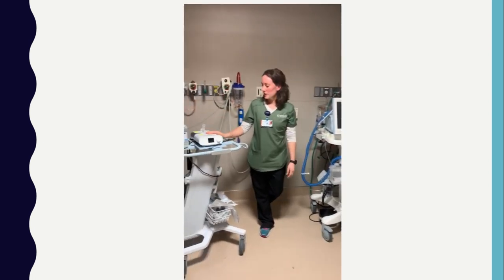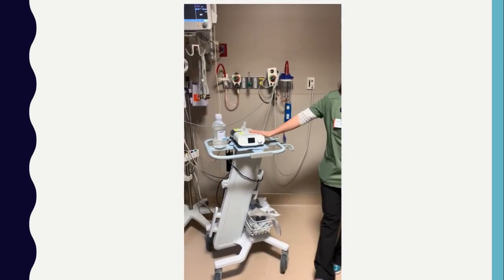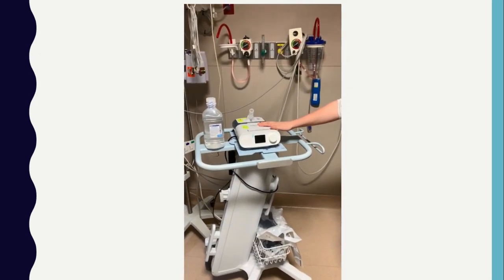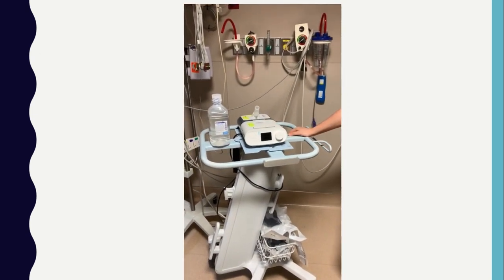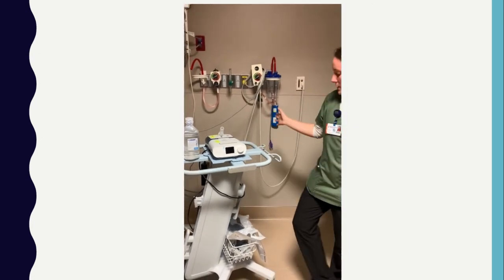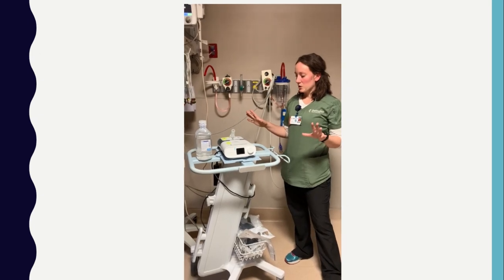So I'm going to start off over here. This is our Respironics DreamStation. We like to call them our baby BiPAPs. These are a lot of times used for patients with things like OSA, to kind of help alleviate some of those symptoms. And there's a few key things to know when you're looking at this.